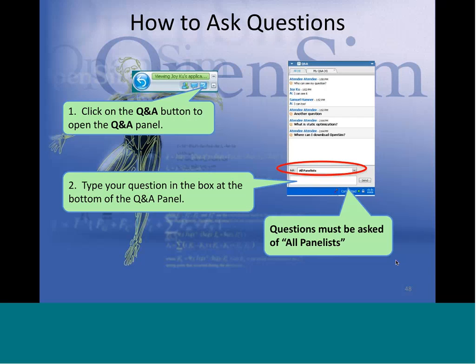Is there a template for how plug-in gait markers can be converted into marker pairs for OpenSim full body model scaling? That's a really good question, and it would be a really great way to compare those two methods. I don't know of one right now, but it's not hard to take your data from that plug-in gait model and move it to OpenSim.